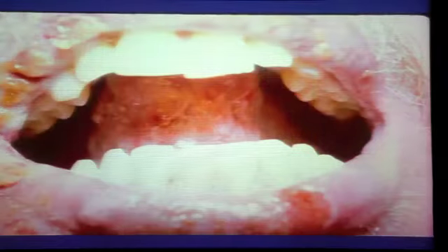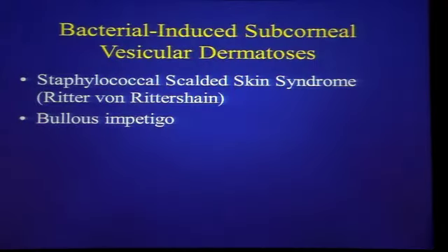So this guy had a lymphoma, developed pemphigus, involved his mouth, and also involved his skin. The features can look very much just like regular garden variety Pemphigus vulgaris, but they can also sometimes have a lichenoid histology as well. This one did not have that, but looked pretty much just like regular Pemphigus.